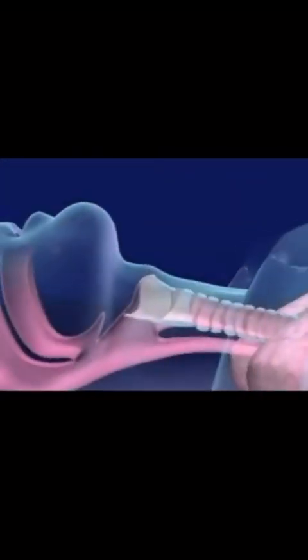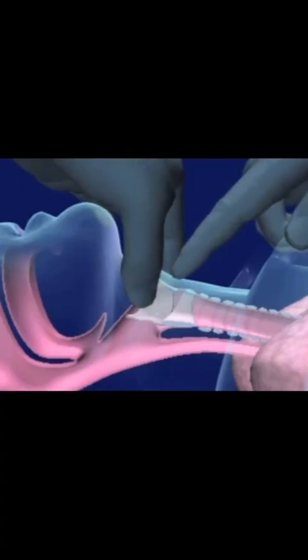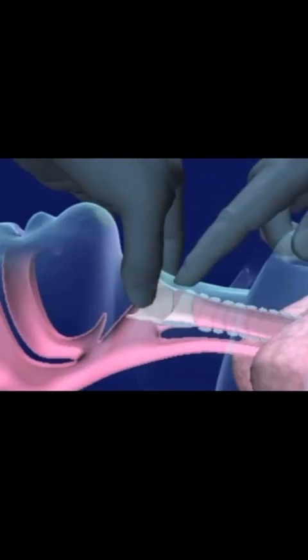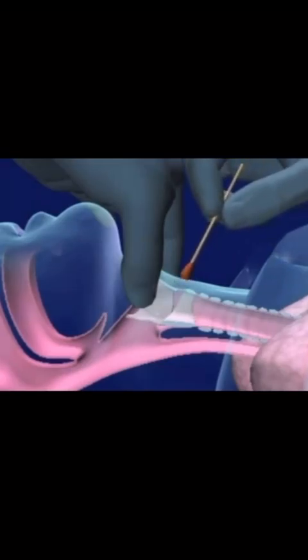Position the patient supine with good access to the base of the neck. Identify your landmarks. Palpate the thyroid cartilage, then the cricoid cartilage, followed by the area between them, which is known as the cricothyroid membrane. Clean the site as per local guidance.